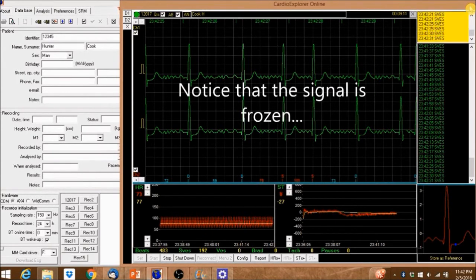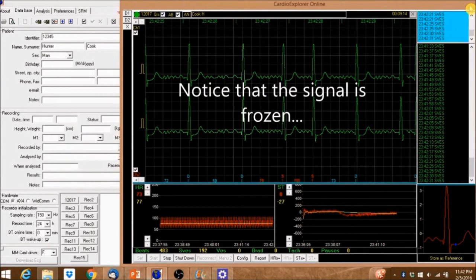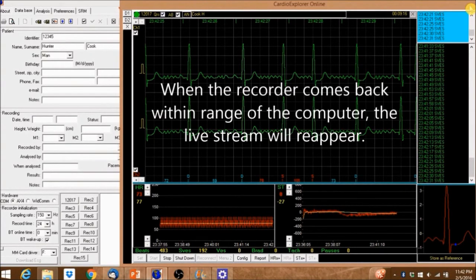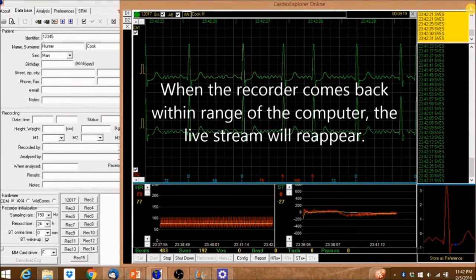Notice that the signal is frozen. When the recorder comes back within range of the computer, the live stream will reappear.